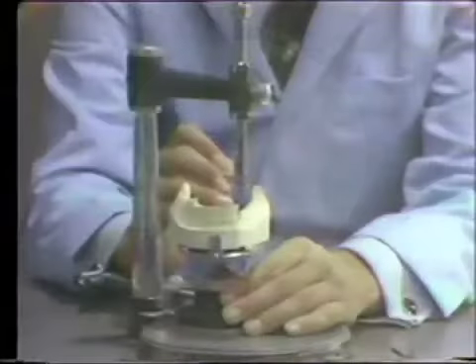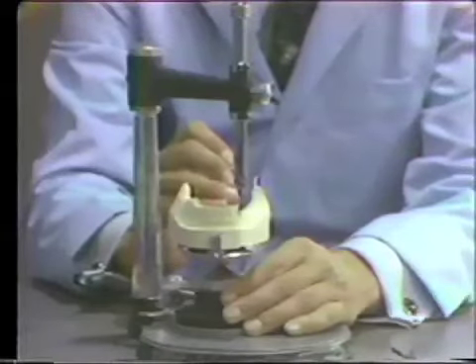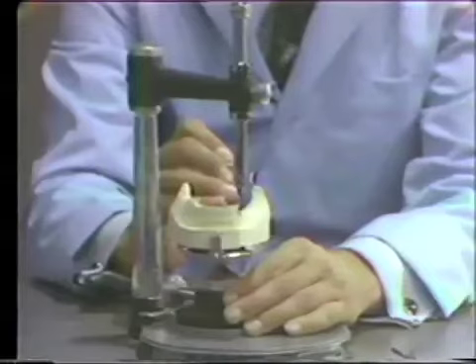Part of the undercut is formed by a notching of that tooth by toothbrush abrasion, but it is not particularly sensitive to the patient, as we found in our oral exam, and it is caries-free. So we do have what looks to be an adequate amount of undercut for clasping in the very center of the tooth. That is the area that we would like to have our potential retention.